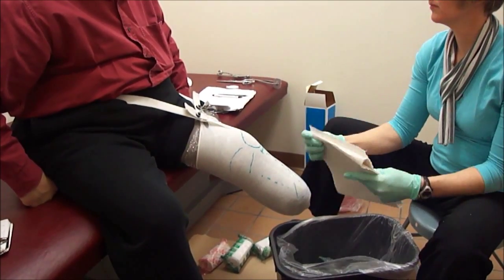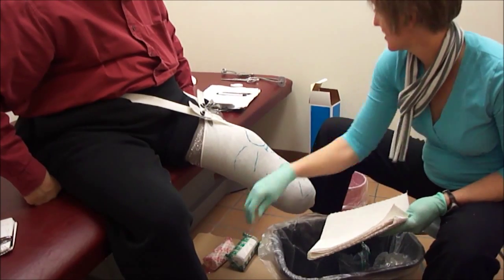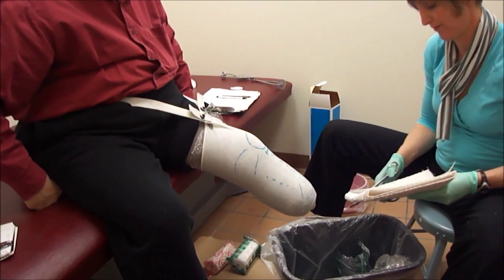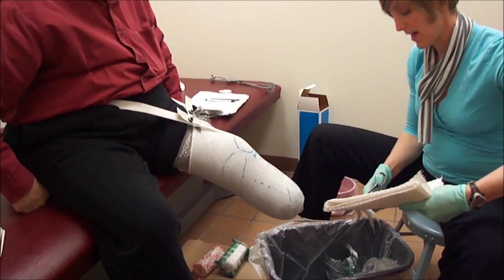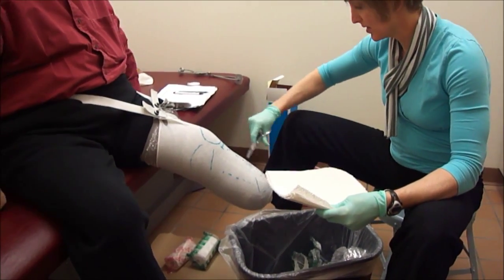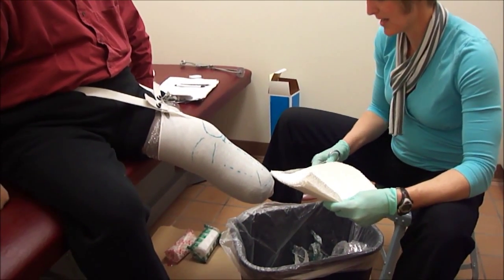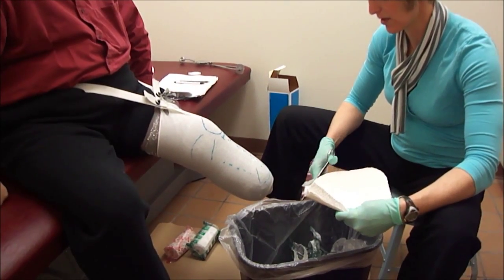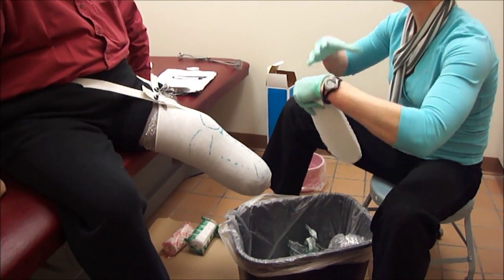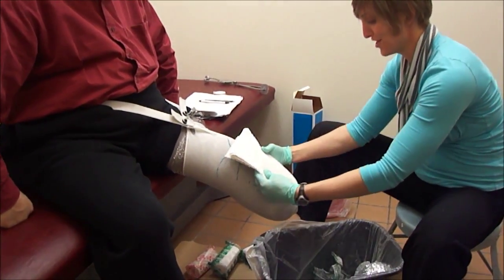Now, are you the one that actually fabricates the prosthesis too? What I do from here is take this mold, and I set time aside this afternoon to fill the mold I take today with plaster, so I'll have basically a 3D model of your leg. Then I modify that. I carve away the plaster in the areas that I want to have more weight bearing, and I build up the areas that I noticed were a little more bony. Once I'm satisfied with the shape, I send it down to Rochester, where there's a team of technicians in our main office who take that mold and form the materials around it. So it is a two-party job.